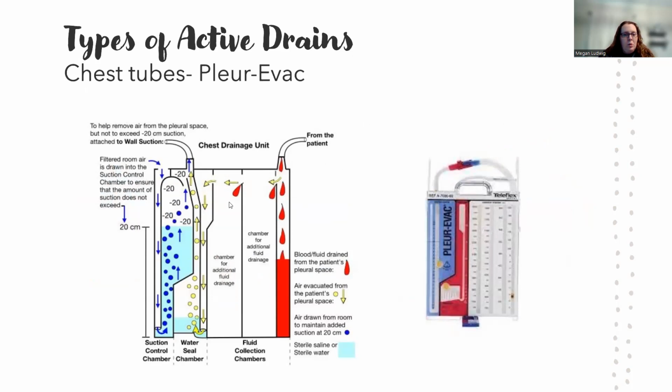It's got extra chambers for drainage, and this here is how it's allowing it to drain, like with the pressure variant. Okay, so it's a little bit odd looking, but really important with any drain, but especially chest tubes, that you are very careful with A, where this is placed, and B, keeping track of it when you're moving a patient from bed to bed.